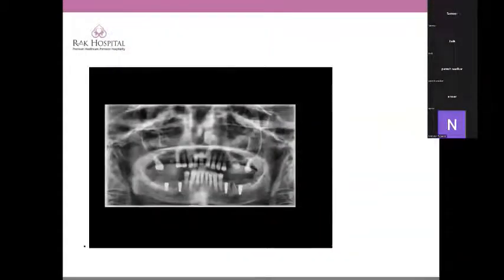And this is the implant. You can see some extra bone graft membrane covering the implant. This is the lower jaw. And in the upper jaw, you can see the sinuses are pneumatized. We hardly have enough bone to place an implant without doing an adjuvant procedure.